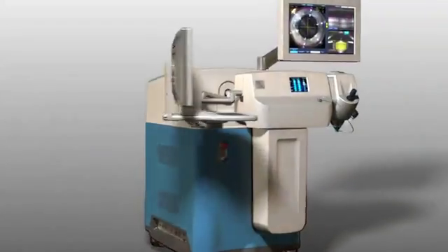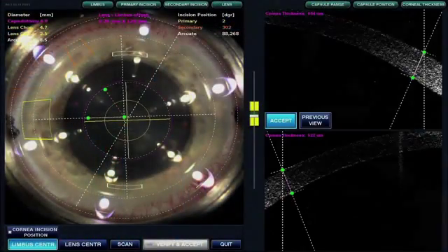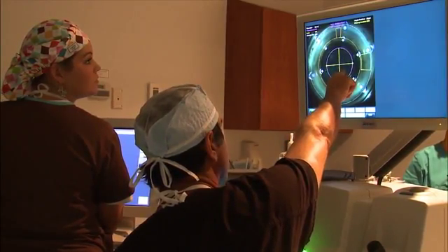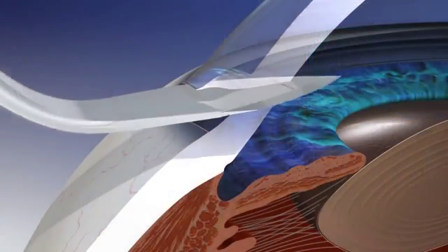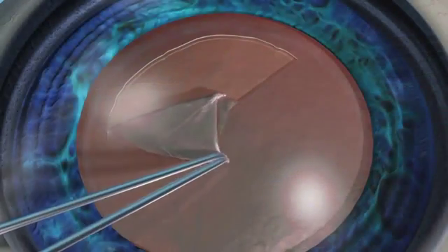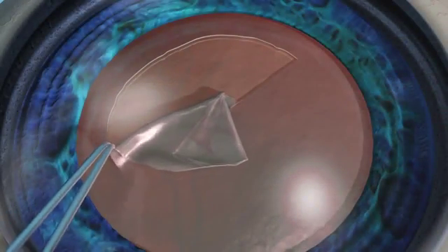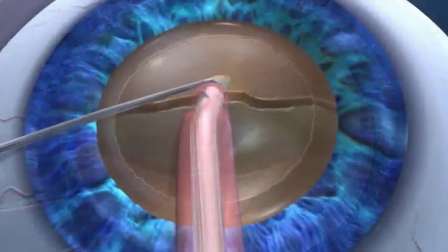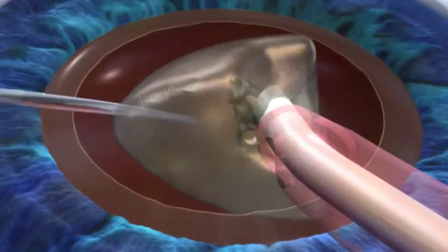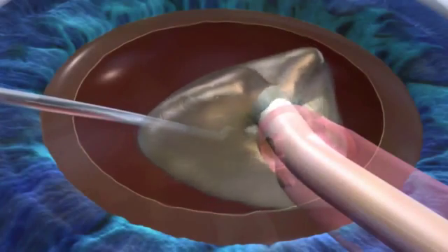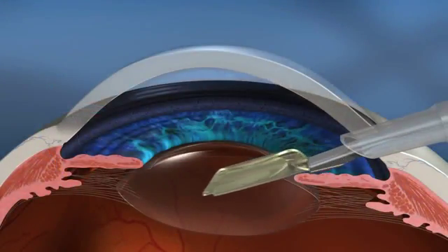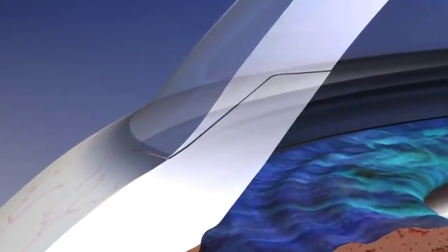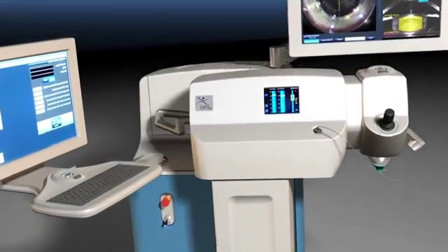Cataract patients now have two options: standard cataract surgery or laser refractive cataract surgery. Cataract surgery involves corneal incisions, capsulorhexis — a circular hole in the capsular bag — lens fragmentation, phaco-emulsification, intraocular lens insertion, and incision closure. The LenSx laser can assist with some of the most challenging steps.